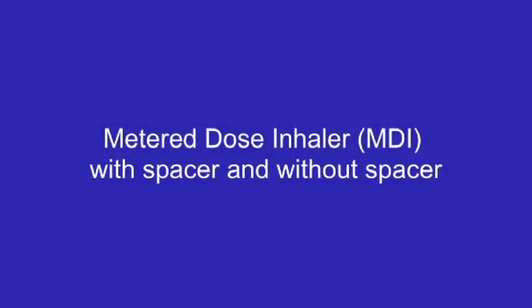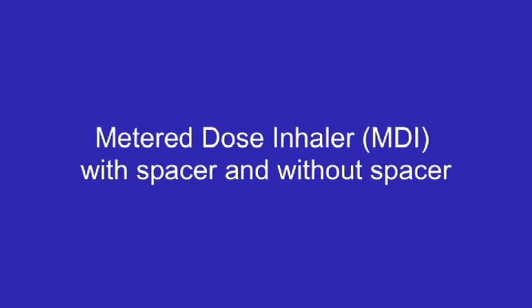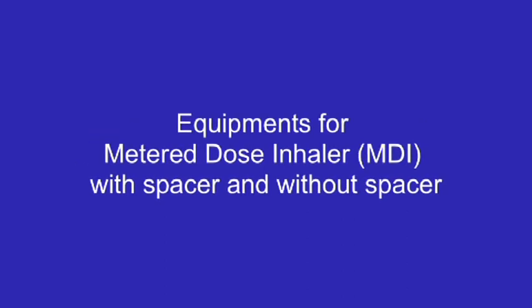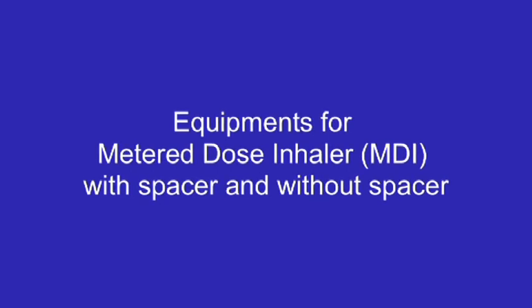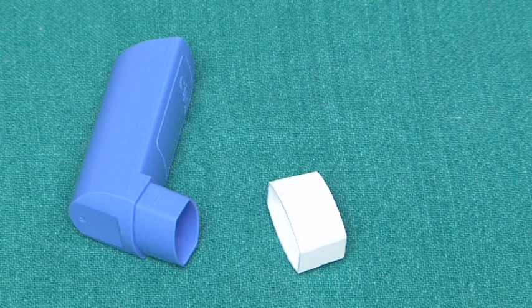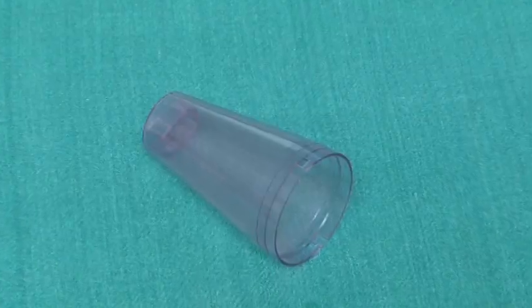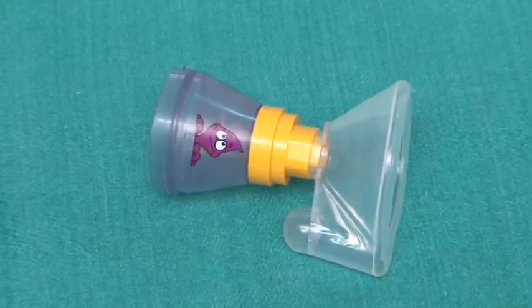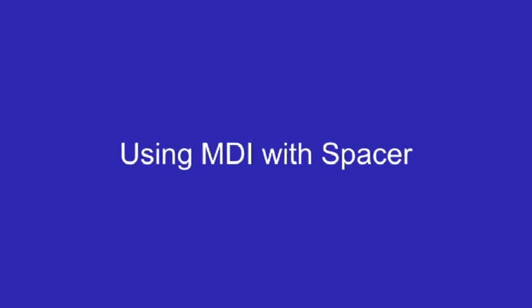Metered dose inhaler (MDI) with spacer and without spacer. Equipment for metered dose inhaler with spacer and without spacer: metered dose inhaler with cap, canister, spacer, and face mask. Using MDI with spacer.